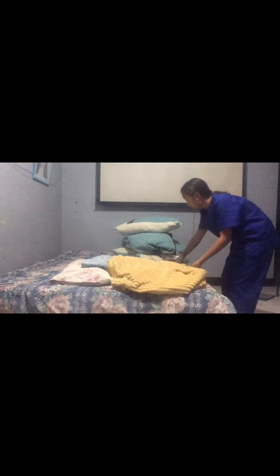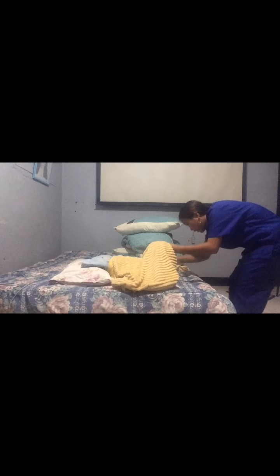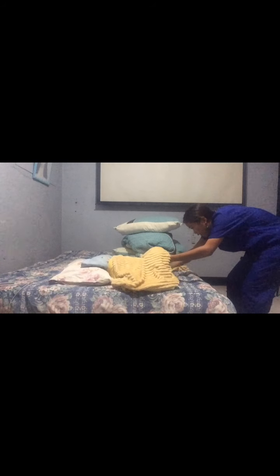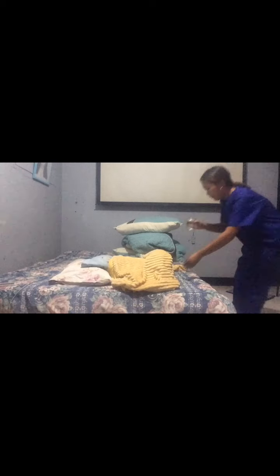Cleanse and dry child's perineum. Apply urine collector to the child by placing child's penis through the opening of the collector if it is male, placing the opening of the collection bag over the child's urinary meatus, avoiding extension over anus. Place a clean diaper on the child.